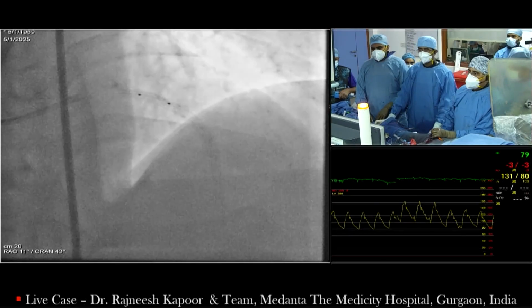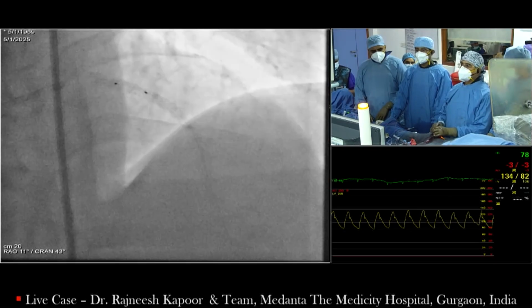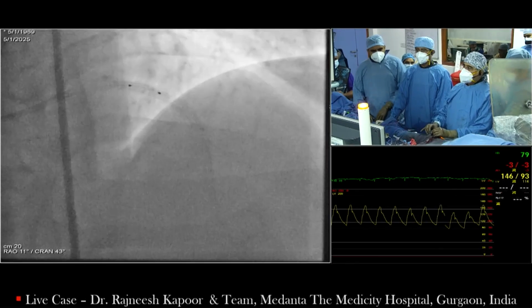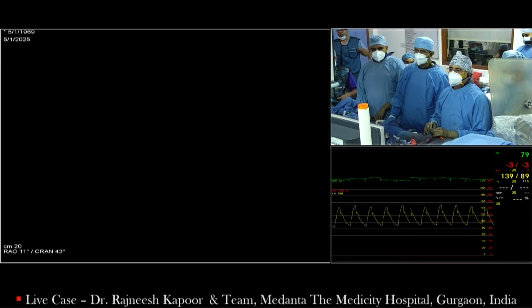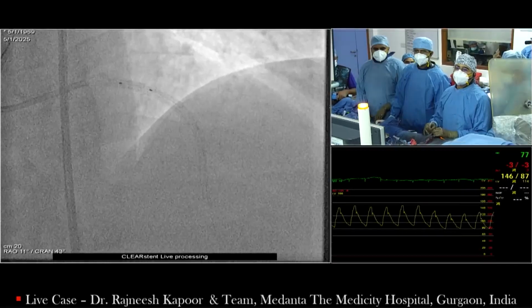So Protege actually is being marketed by Translumina here. They have stents, and it's practically with the collaboration of some German company. They have made this DEB, and we are doing a study on that DEB also here. Okay, show me that. So Translumina is a company that distributes in India and Pakistan.